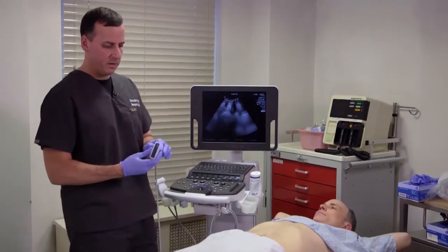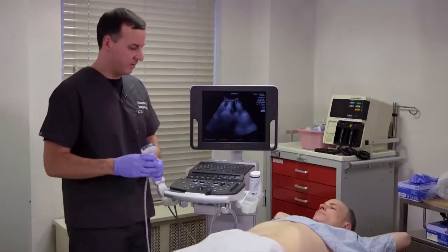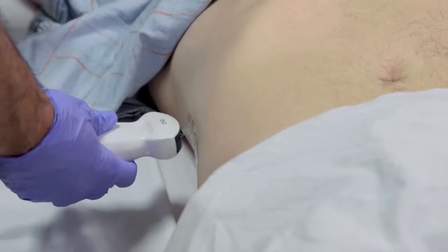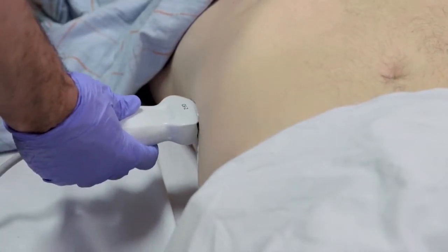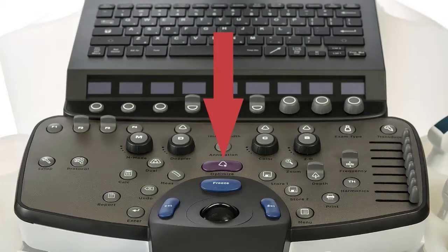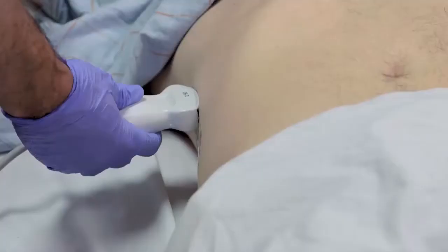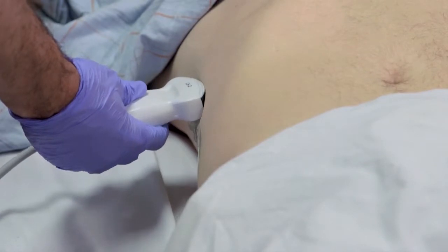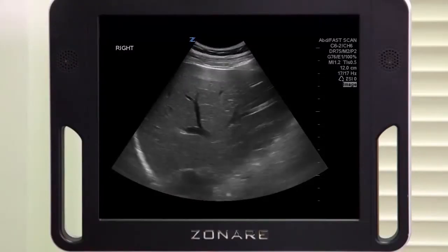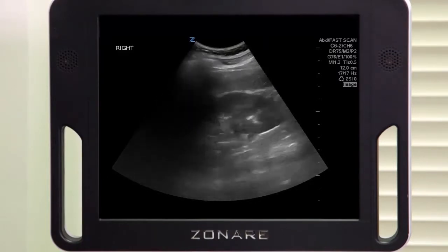To start the exam, look at your transducer and find that notch. It's going to start out facing the patient's head at the mid-axillary line, and typically you'll catch part of the liver there. The Zonare system has an optimized button that's really helpful, especially for more novice sonographers — it's going to optimize your image. We see liver here. What you're going to do is fan up towards the ceiling and down towards the bed, until you run into your guide in the FAST exam — which is your kidney, which we're seeing here.